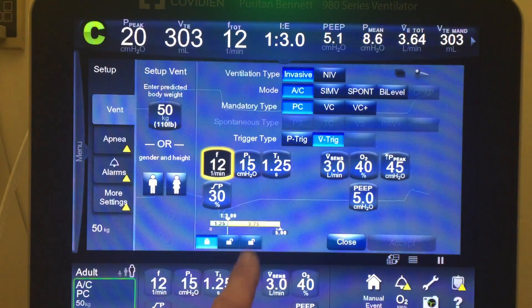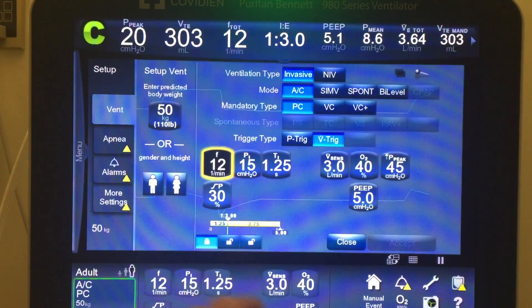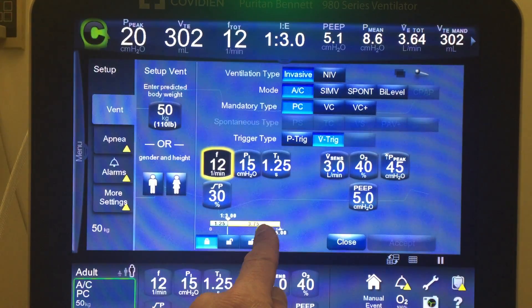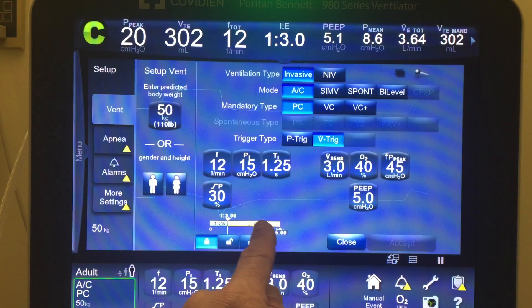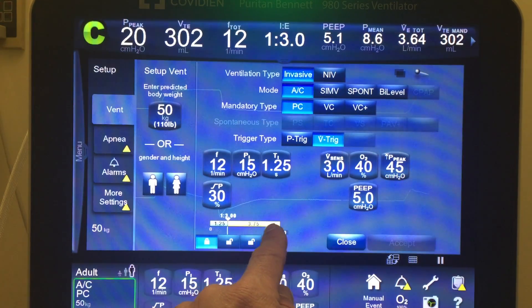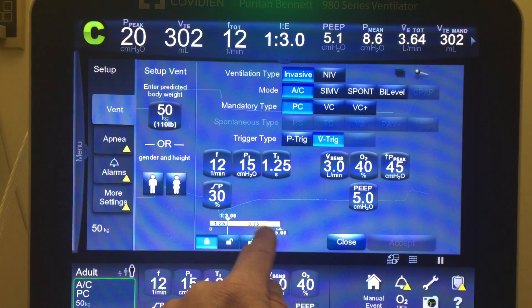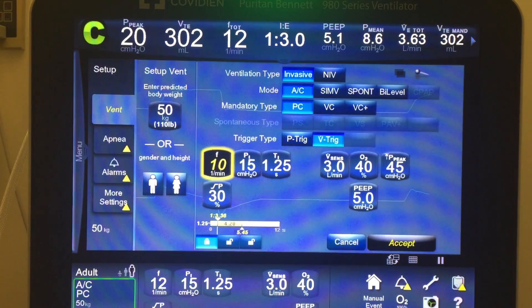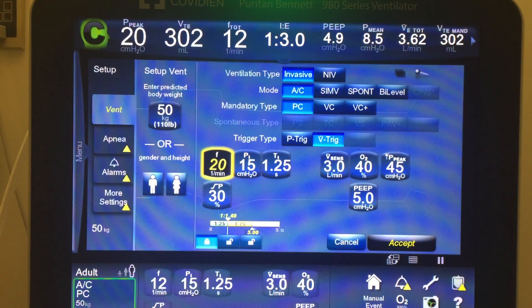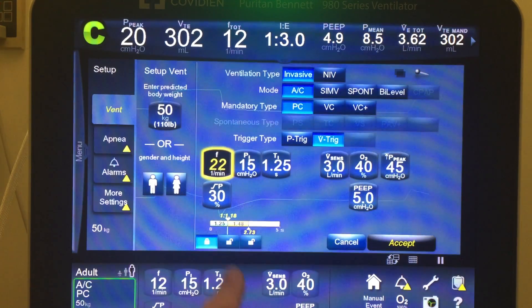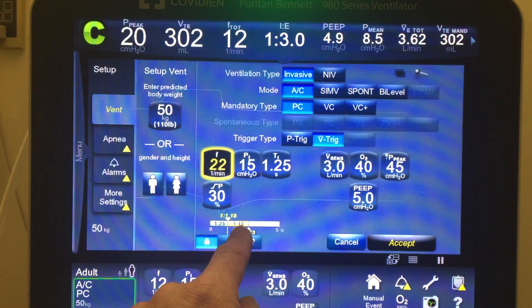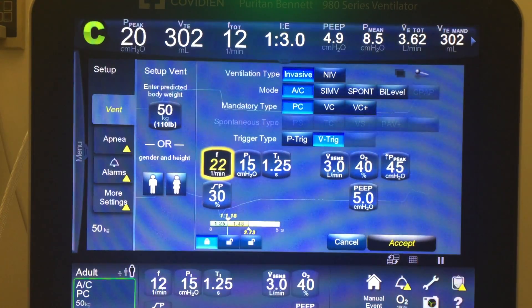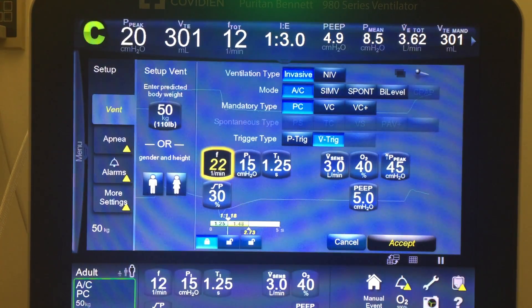Let's change the rate. If I increase the rate, cycle time is going to shorten, and it's going to take it out of E-time, not I-time, because I'm holding that constant. There we go — I'm rolling the rate up, and you can see I-time is constant, but it shortens E-time and changes my IE ratio.